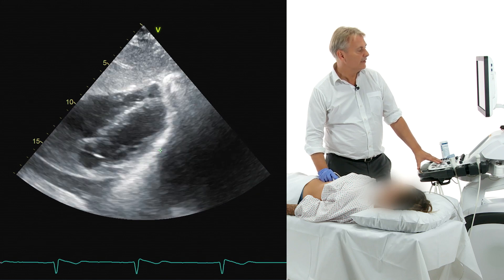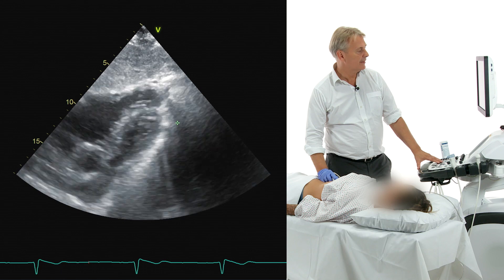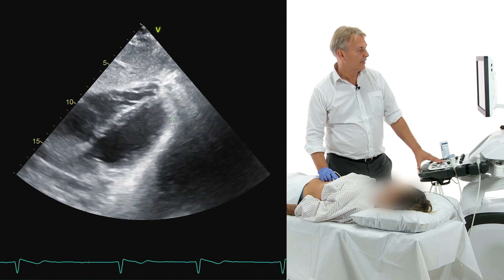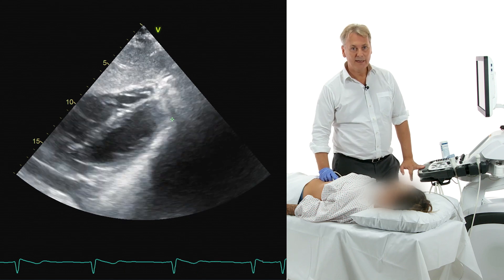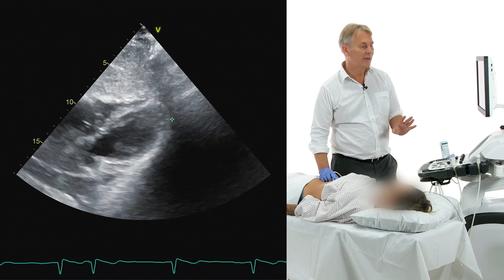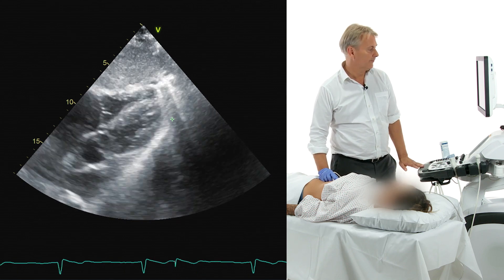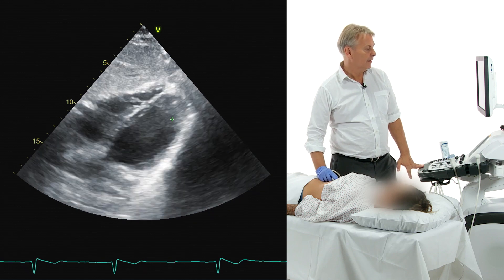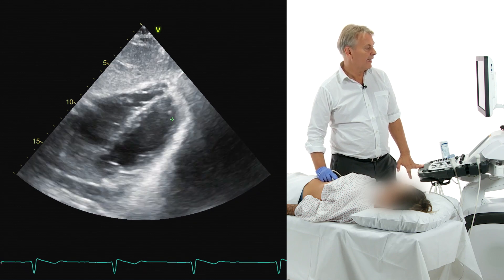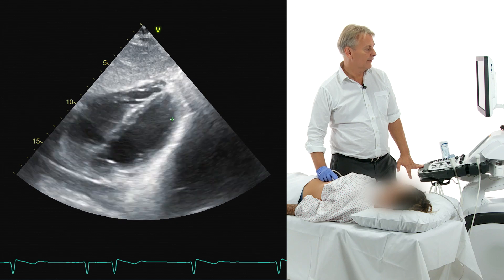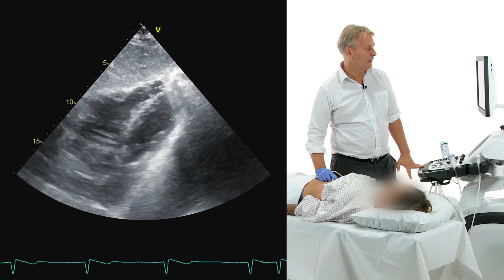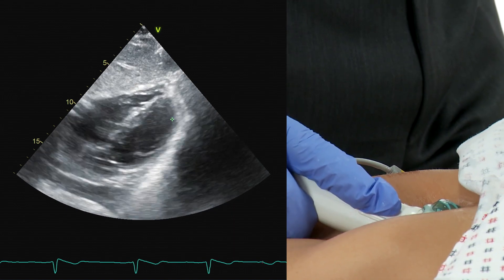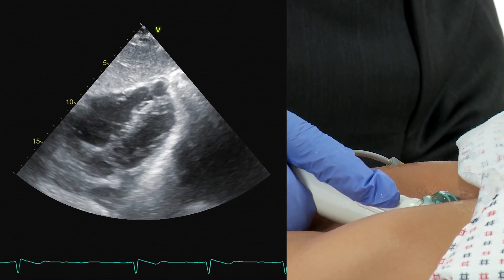Very frequently you cannot see the apical structures because of gas, so the subcostal view is usually not ideal to image the apical structures. But you can use variants of the four chamber view by rotating and tilting the transducer. Thereby you can display a kind of five chamber view, where you would have the aortic valve.